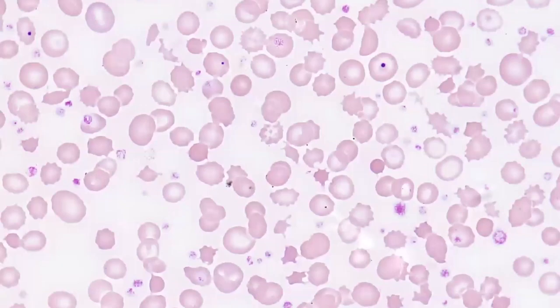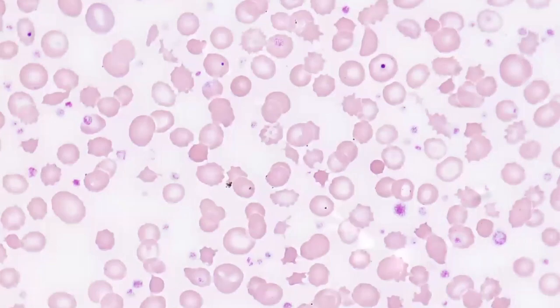Acanthocytes do not deform as readily as a normal red cell, and as a consequence are often sequestered in the spleen and destroyed. Clinical conditions associated with acanthocytes include abetalipoproteinemia, hypobetalipoproteinemia, and advanced liver disease. Mild to moderate acanthocytosis may be associated with a post-splenectomy state, vitamin E deficiency, malnutrition, or myeloproliferative disorders. Some laboratory tests to evaluate when seeing acanthocytes is to check liver function.